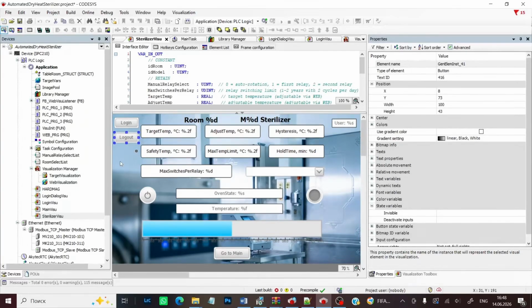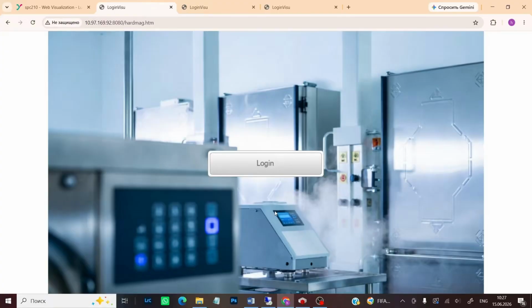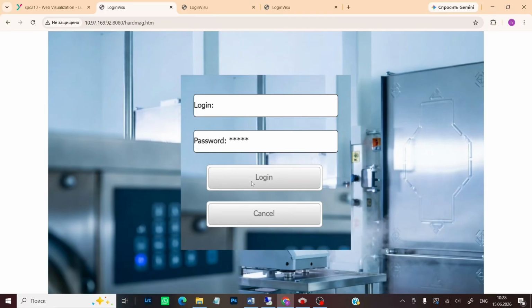Let's demonstrate how all of this works. When connecting for the first time, all unauthorized users are taken to the registration page. After clicking the button, our custom user authorization dialog window pops up.